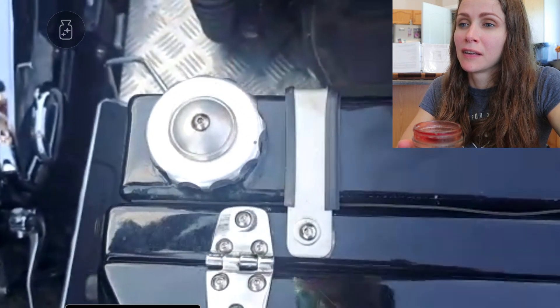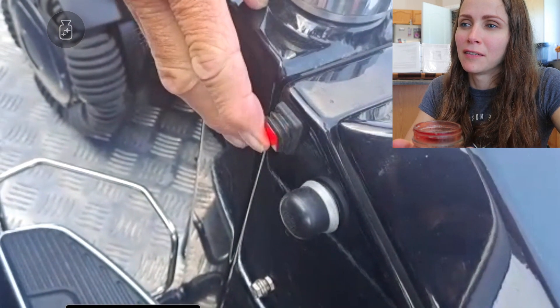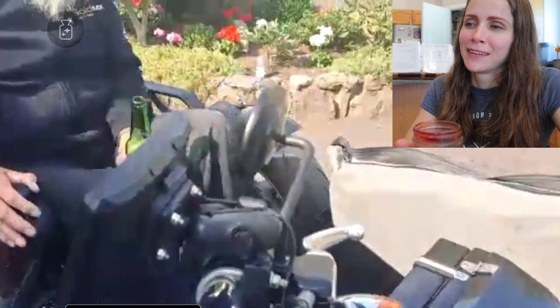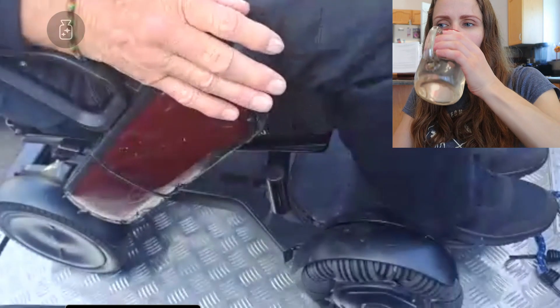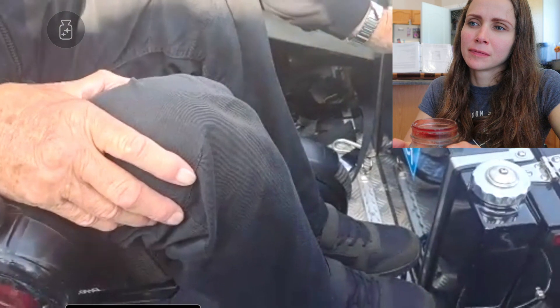Up here is a 16-litre auxiliary fuel tank, so I've got extra fuel. It pumps fuel directly into the Harley fuel tank with this button here — you can hear it. I can flick that while riding along. We also put tie-down points in, and I put straps through the wheelchair itself so it doesn't bounce around on rough roads.